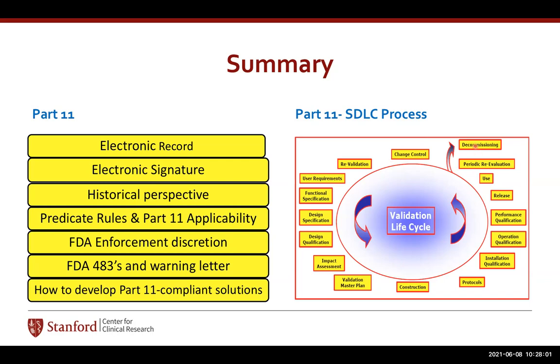What I did not discuss is the decommissioning. A device has a certain life, or a system has a certain life period. And a time comes when you think, I just want to retire that. There are FDA regulations about that also, which is called decommissioning. So you have to really retire or decommission a system, but then you have to document that properly because it was used in the past, perhaps even keep that device for some time.